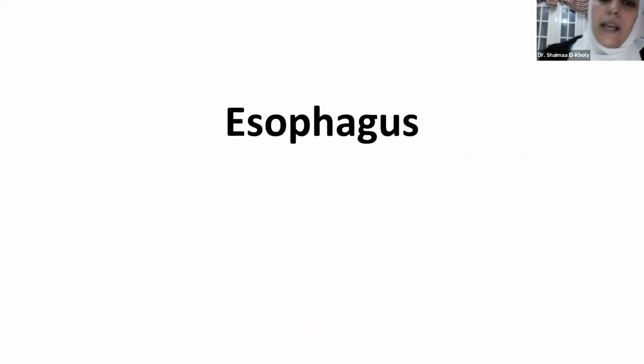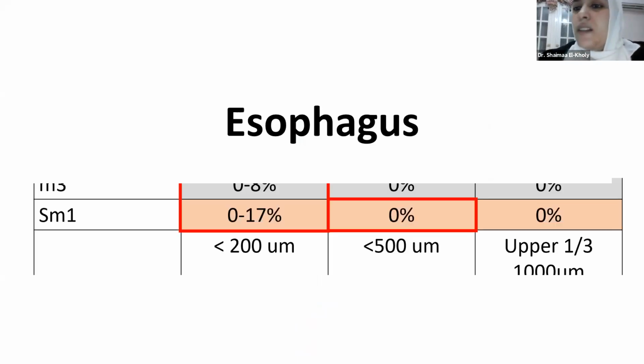Okay, but it will not be practical if I bring all the guidelines in one lecture. I will need a series of lectures. I just want to show you that it's not only the depth of invasion that is regarded as an indication for ESD.